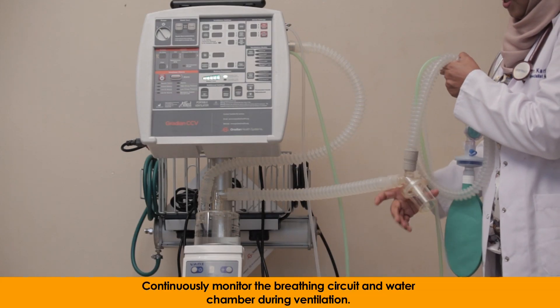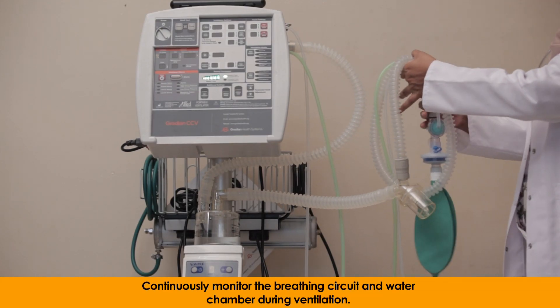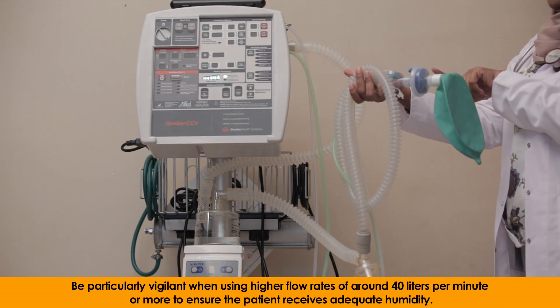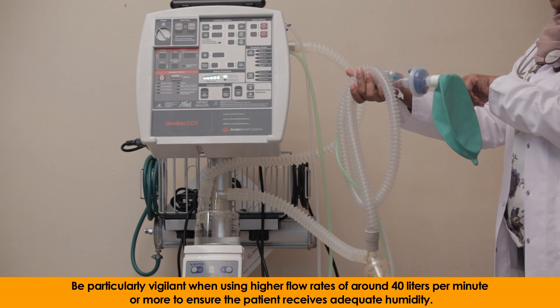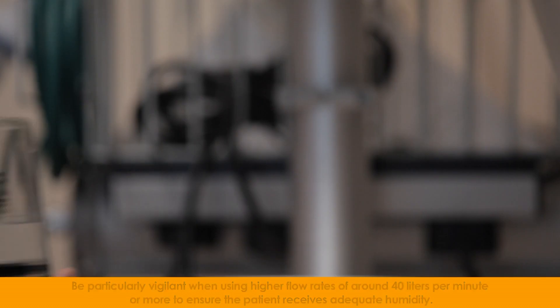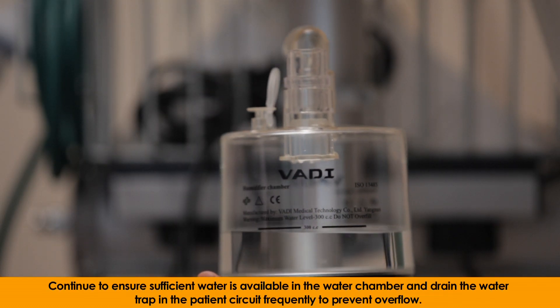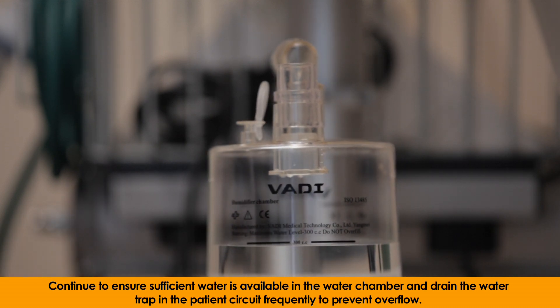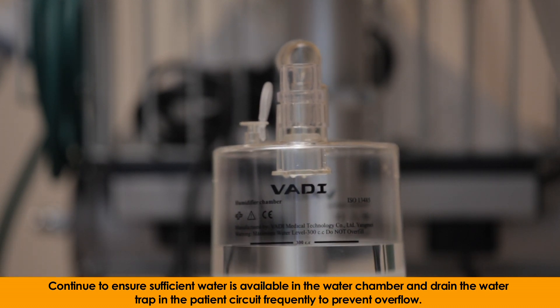Continuously monitor the breathing circuit and water chamber during ventilation. Be particularly vigilant when using higher flow rates of around 40 liters per minute or more to ensure the patient receives adequate humidity. Continue to ensure sufficient water is available in the water chamber and drain the water trap in the patient's circuit frequently to prevent overflow.